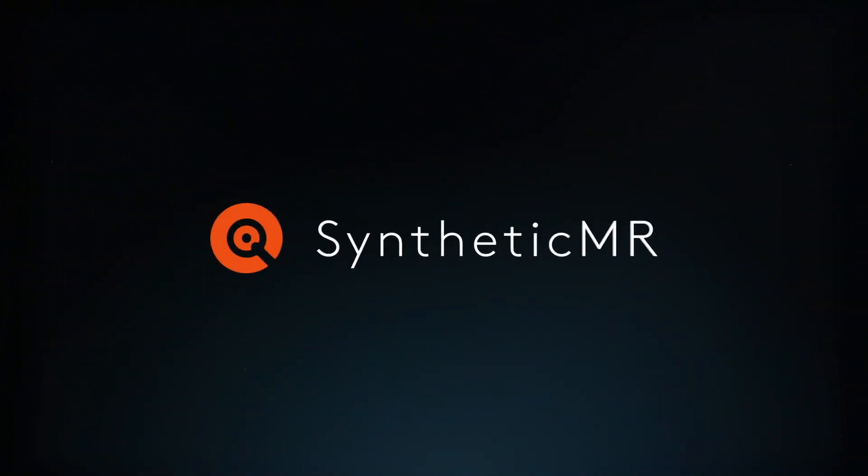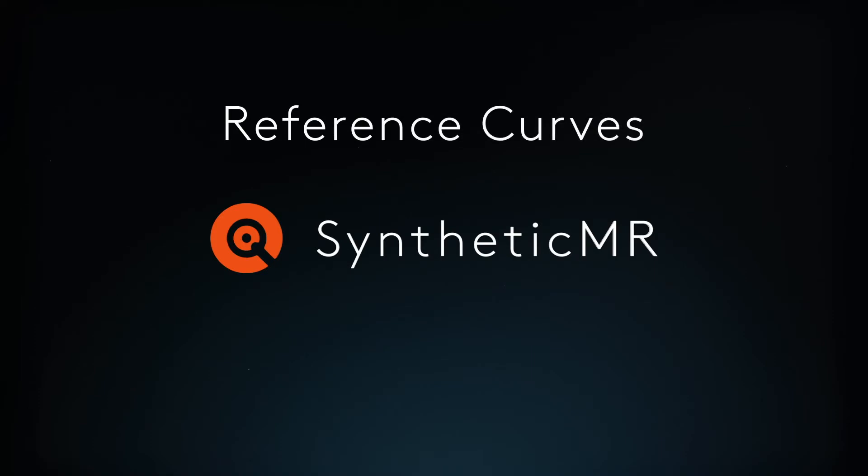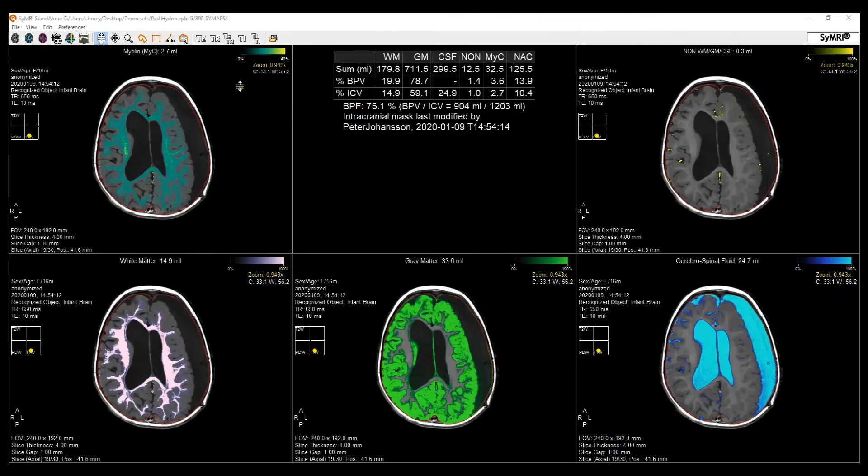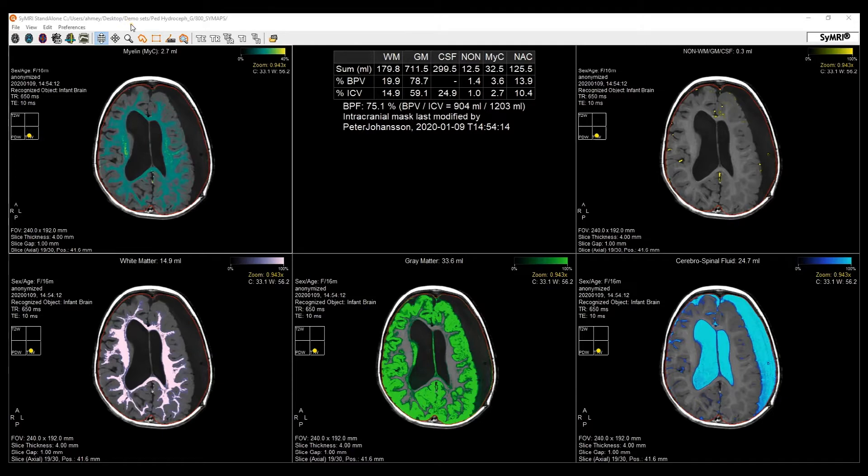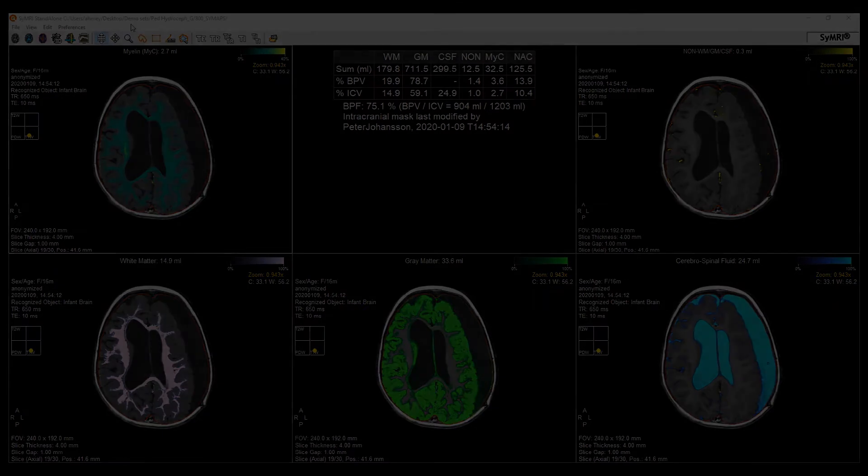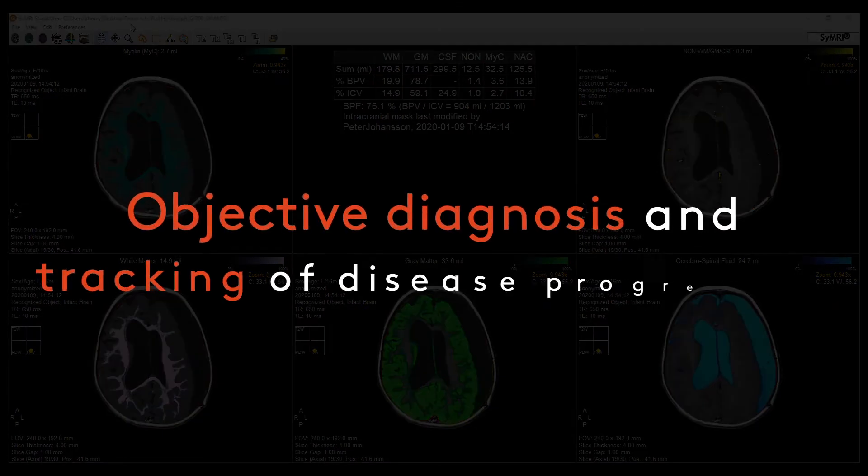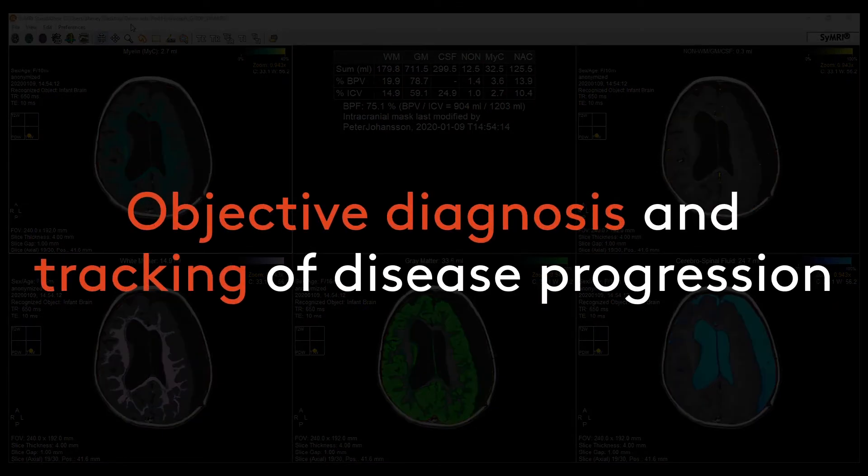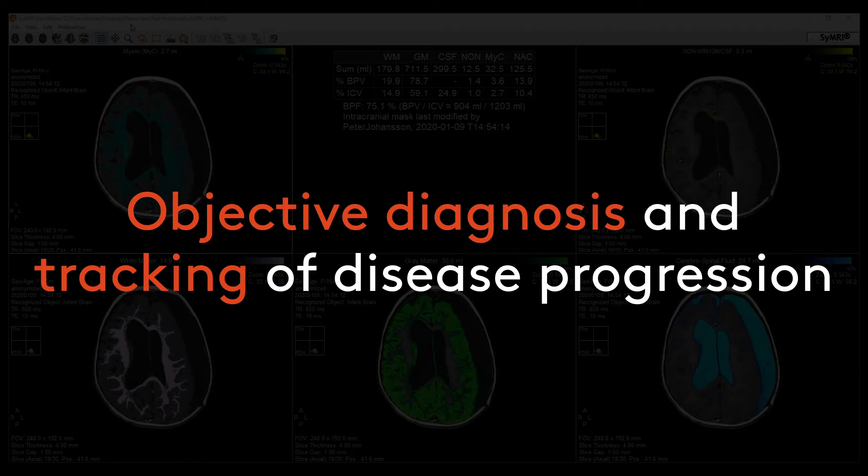Hello, my name is Ahmed from SyntheticMR, and in this video I'll be talking about the reference curves that SyMRI provides for the different quantitative tissue maps and volumetric measurements. This helps make for a more objective approach towards diagnosing and monitoring of treatment efficacy in different disease states.